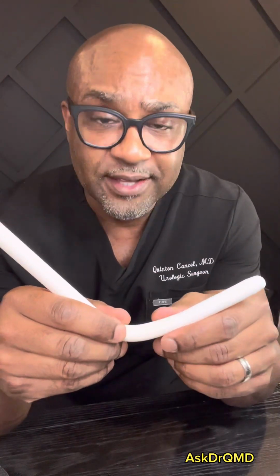Obviously this is less desirable because it does not inflate or get larger in any dimension. It simply is able to be malleable and to bend. It'll be straight enough to do the job, but no real frills or thrills with this, other than hopefully you will be able to achieve penetration with it. People who qualify for this are people who have had previous failures of prosthetics or erosions of the prostheses. If so, they cannot have another inflatable prosthetic, and so they would need this in order to prevent another erosion.